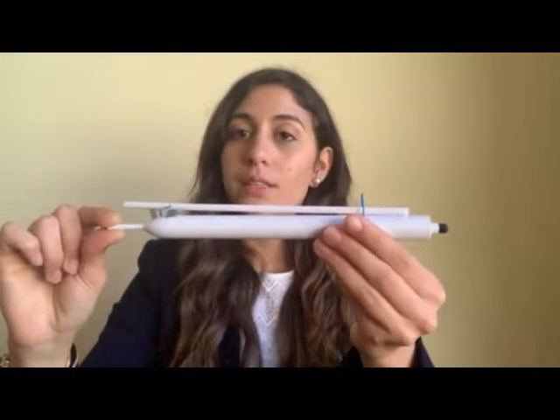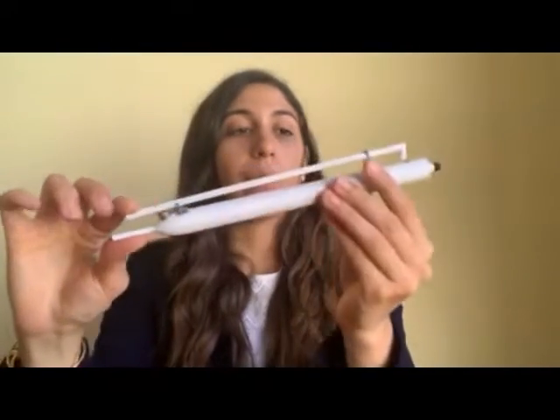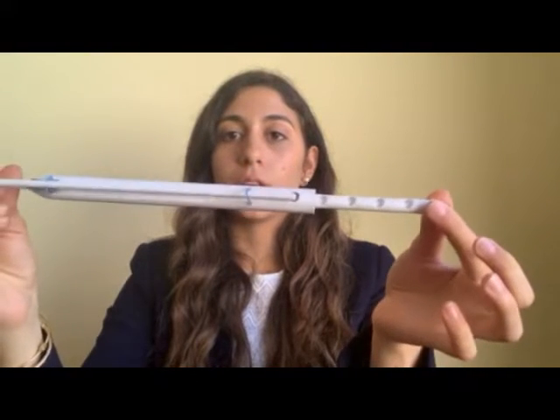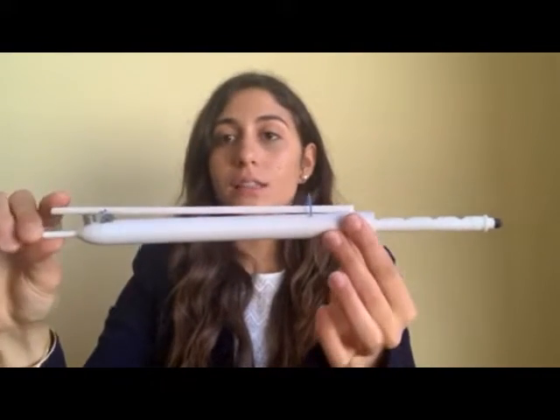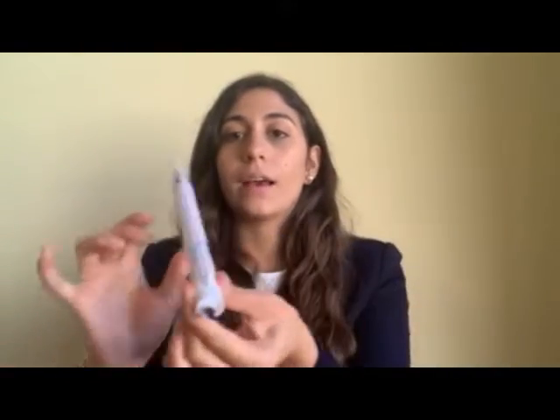However, if they would like to extend that, they can simply bite down on this clip over here and blow into this hole on the mouth end, which will cause the inner tube to expand. And then once they release the clip, it will securely go into the nearest notch. And if they would like to retract it, they can simply bite down again, tilt their head back, and it will lock back in its initial position.